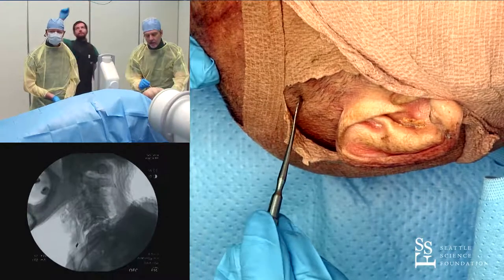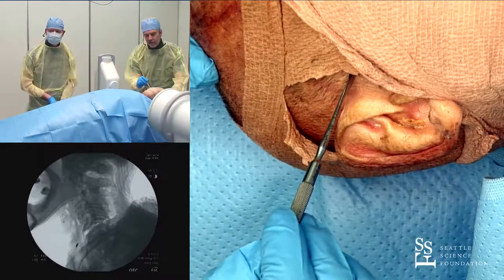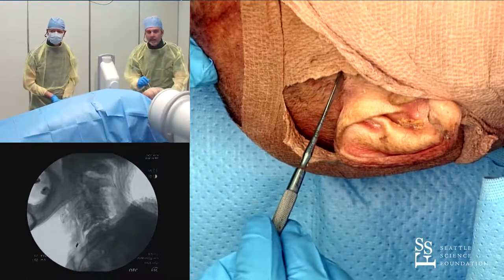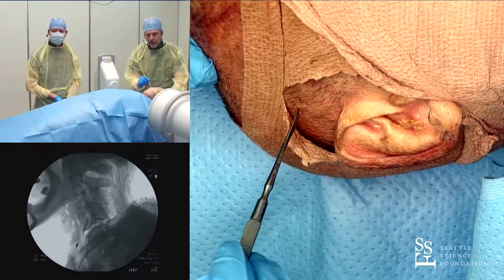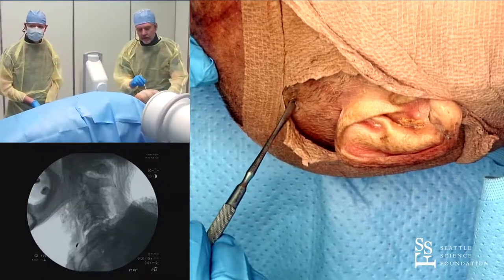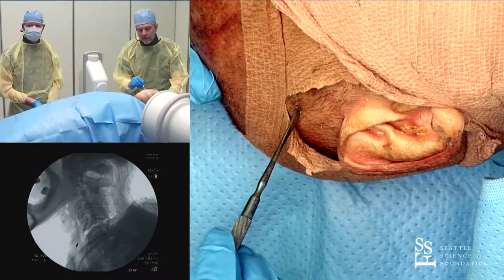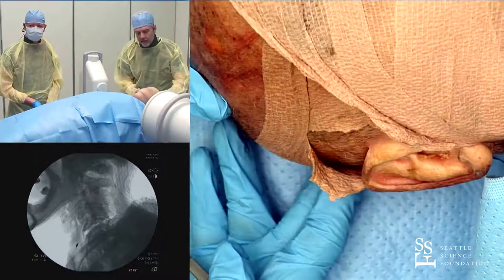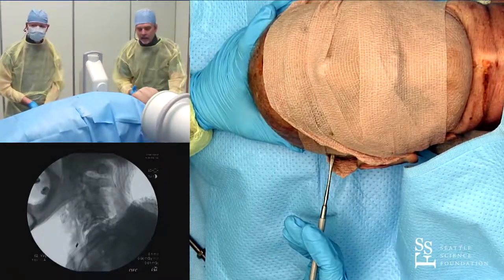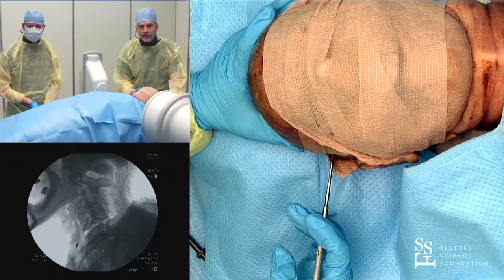That placement stays below the equator of the skull and out of the temporal bone, which is obviously very thin. You don't want the tongs up here because you can punch right through the skull easily. The thickest part of the skull, just below the equator, is where I make my entry point. I'll then use local anesthetic, raise a wheal, inject down to the periosteum, and make sure the periosteum is well anesthetized.